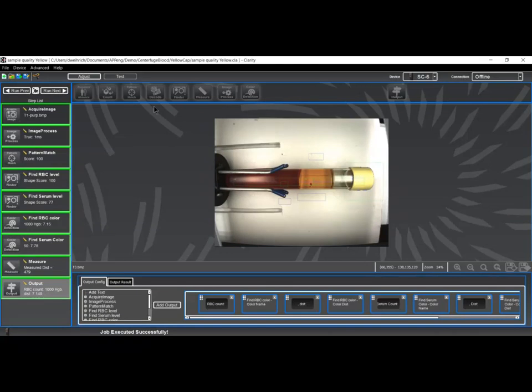And now the last step is added into the script here, and this is probably the culmination of all the measurements, which is to output all the measurements. In this case, I can output values from any one of these steps. For instance, here I've had a text box that basically puts out a string that says RBC count. Then I add a value from find RBC color and find the color name. This basically is the name that I gave that color on the reference table. In this case, the name was a particular hemoglobin value.